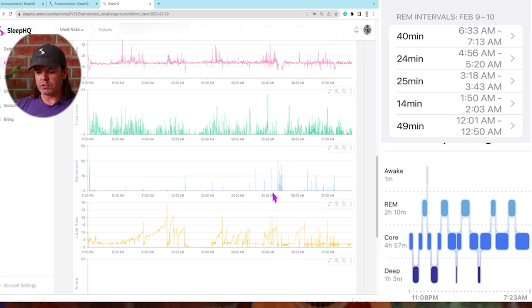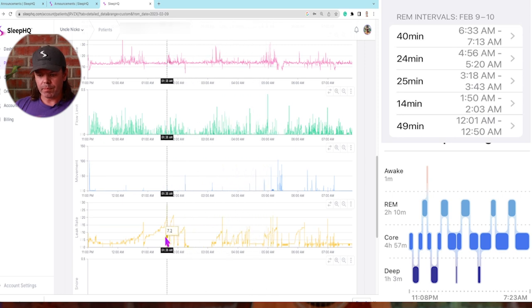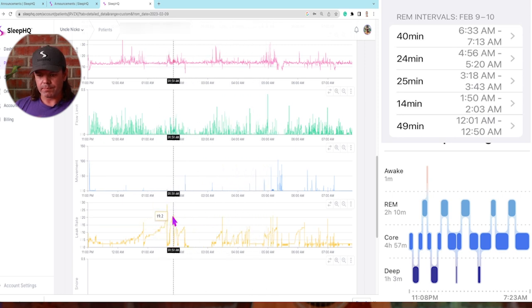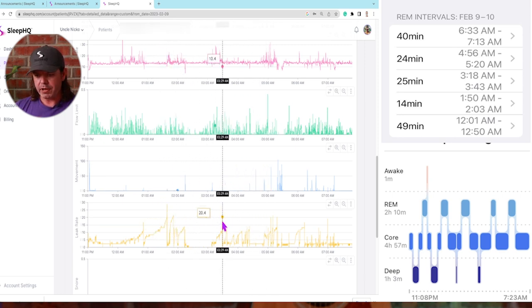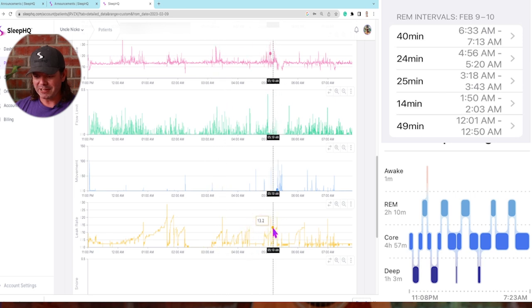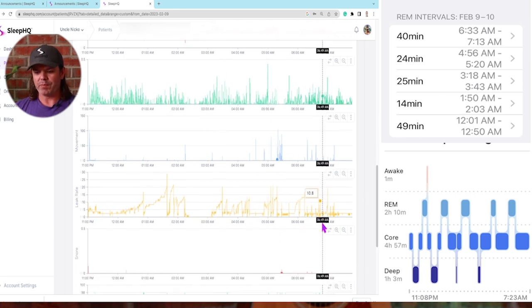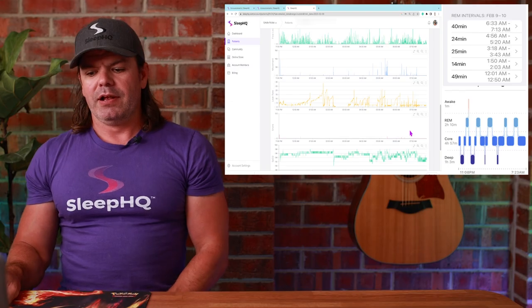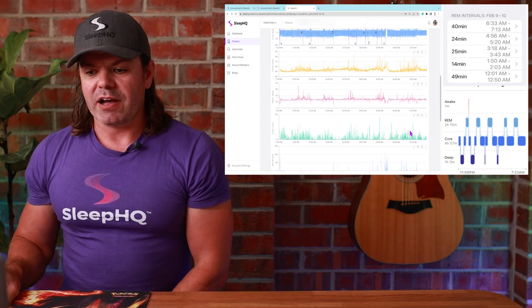We've got some snore associated. But look, every time, there's one REM period, second REM period, third REM period. Look at the leak, fourth REM period. Crazy stuff, eh?